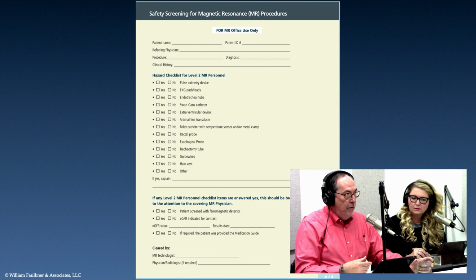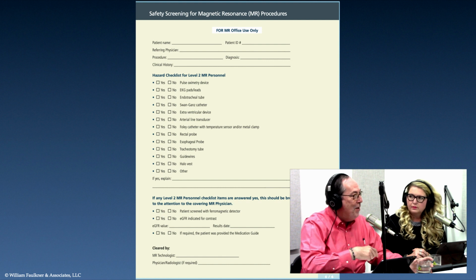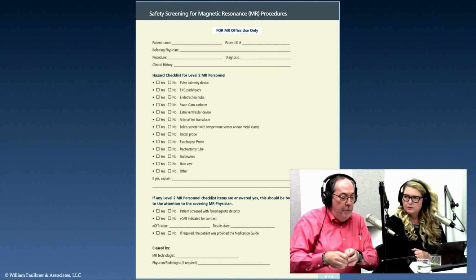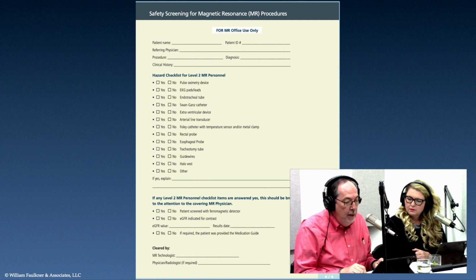Right. I was told there's like 10% mortality for explanting a lead because it's screwed down in the myocardium like with a little corkscrew, and you just don't jerk it out. You don't put your foot on it and pull it out. They just don't do that, so they're always going to leave it.